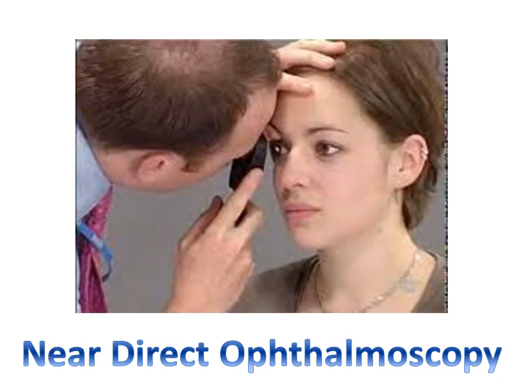This is the picture of near direct ophthalmoscopy. You have to go as close to the patient as possible and peep through the pupillary area to visualize the posterior segment structures properly.